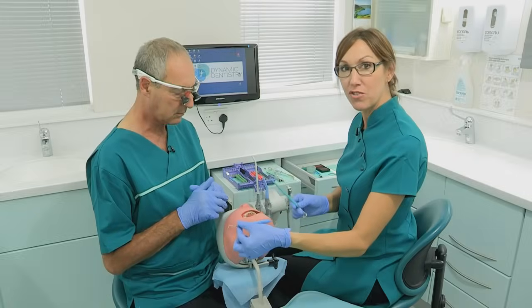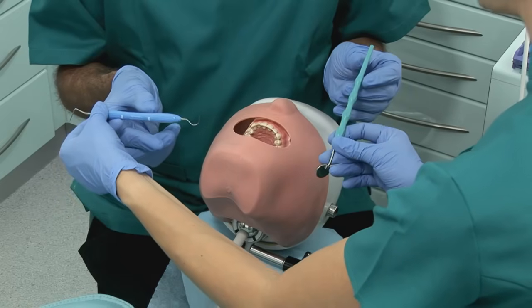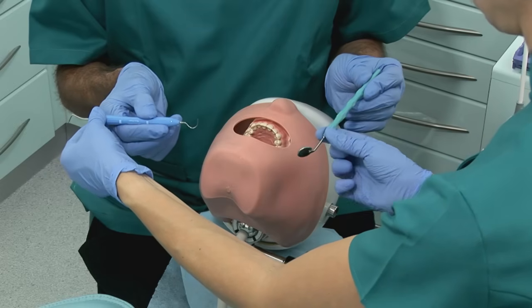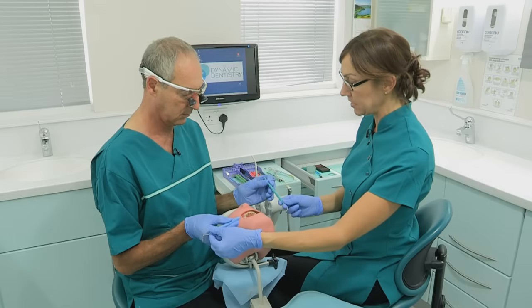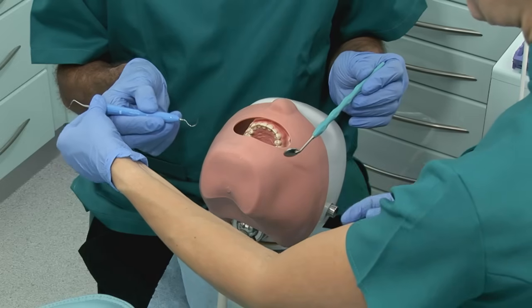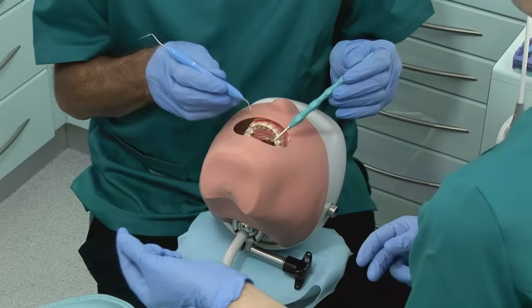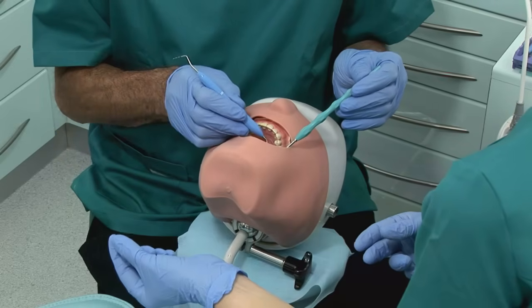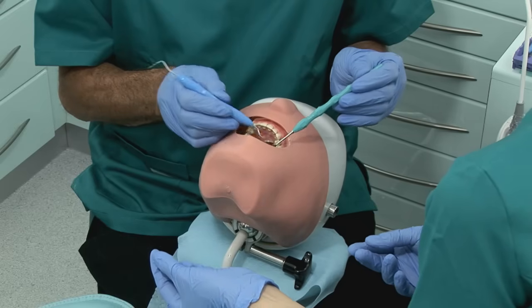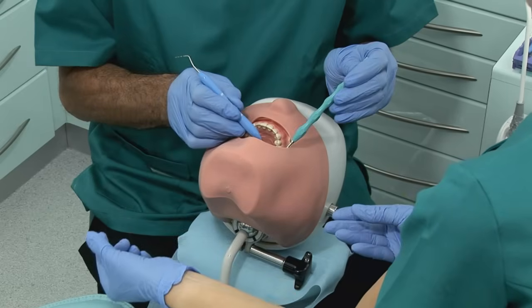When I pass the instruments across to Martyn, I'm going to hold them in exactly the way that I can place them into his hands and know that he doesn't need to adjust them at all. So I'm holding the mirror at the far end so I can place it into his fingers, ready for him to hold it in the position he needs to. And again with the probe, I'm holding it so he can hold it in a pen grip close to the end. I check the tooth because I haven't taken my vision off the tooth at all. And I actually don't see those instruments being passed to me, and they can be taken away safely and then passed back to me if I need to do it again.